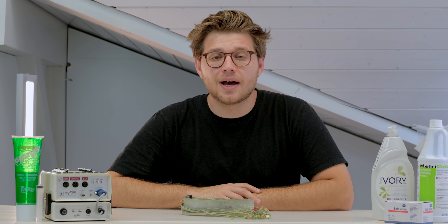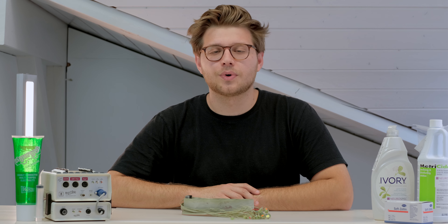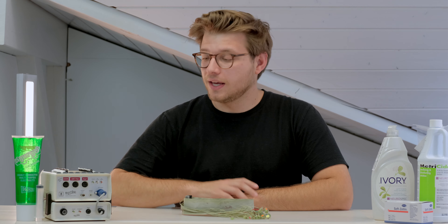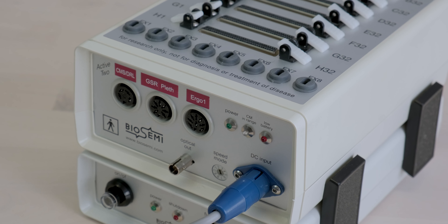So you've just finished your EEG acquisition and now it's time for the tedious task of cleaning up. We all want to stay clean and safe, but how can you make sure you're cleaning your electrodes properly? Here we have the phenomenal Active2 EEG system from BioSemi, but the process looks the same across the board with all of your systems.